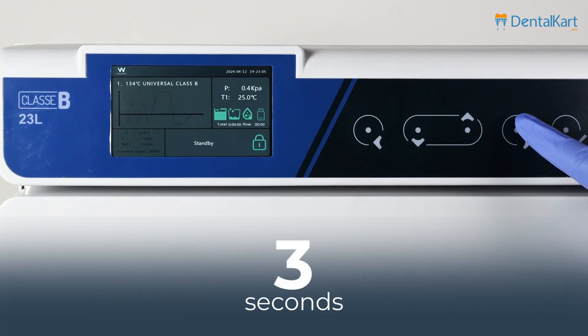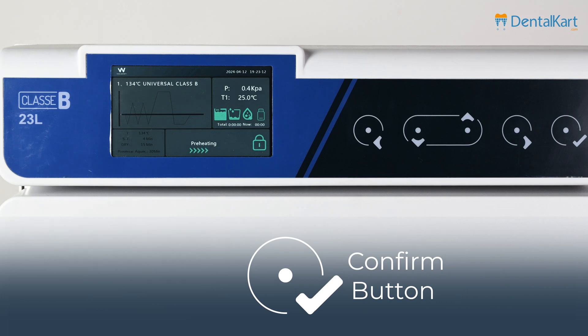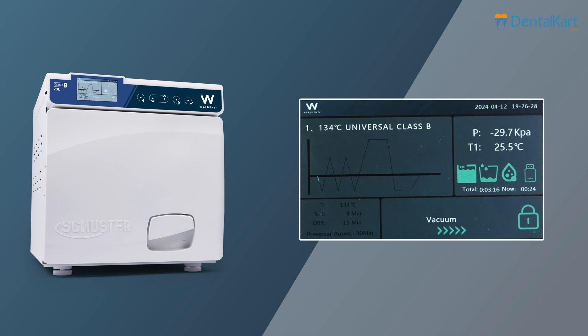Press the right button for 3 seconds and the start prompt will appear on the screen. Press the confirm button to start the cycle. Different cycles have different sterilization times. The phases of sterilization are: preheating, followed by vacuum, then heating — repeated three times — followed by sterilization, exhausting, drying, and the balance or return period.